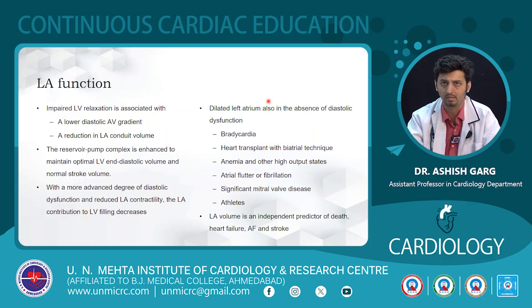However, the left atrium may also be dilated in the absence of diastolic dysfunction in patients with flutter, fibrillation, significant mitral valve disease like mitral stenosis, anemia and high output states, and in athletes. So this needs to be kept in mind, that dilated LA may also be seen in the absence of diastolic dysfunction, as mentioned.